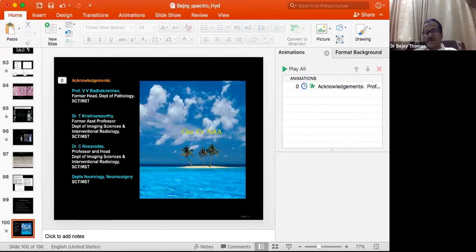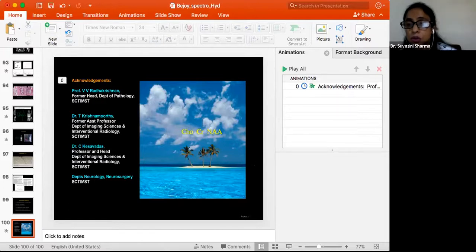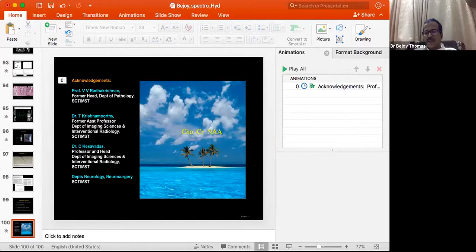So does prematurity in HI affect MRS findings in a metabolic disorder? We talked about some of the prematurity and HI, hypoxic ischemia. Yes, the prematurity will definitely, in premature infants, small amount of lactate is supposed to be normal. So in hypoxic ischemia, lactate level can increase, and lactate is actually a marker for prognostication.